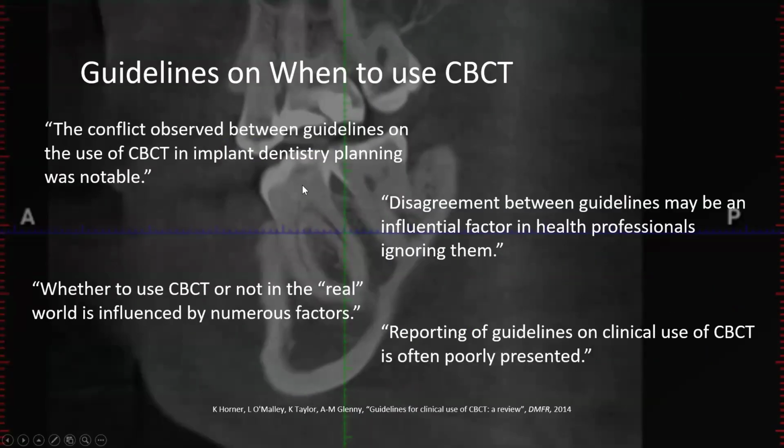So this is like most guidelines they give you for when to use things. It's kind of similar to if you read through that PDF I gave you for the ADA guidelines on prescribing radiographs. They give you some guidelines, but then ultimately it comes down to using your clinical judgment, right? You're the professional. And so a lot of these guidelines are pretty confusing. These are from reviews of different guidelines.